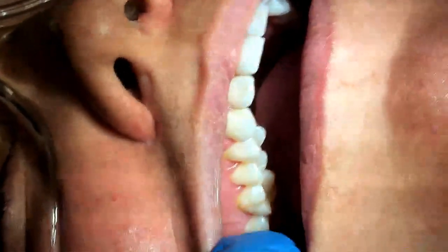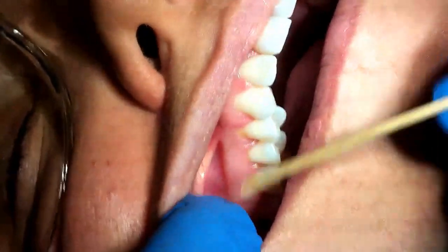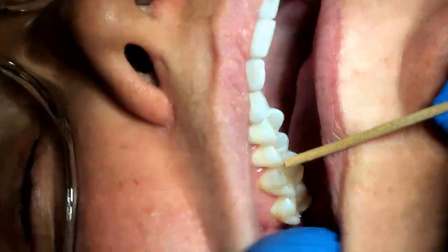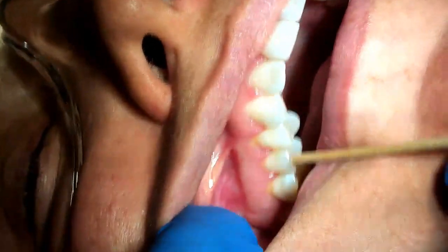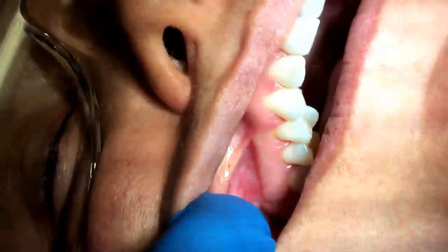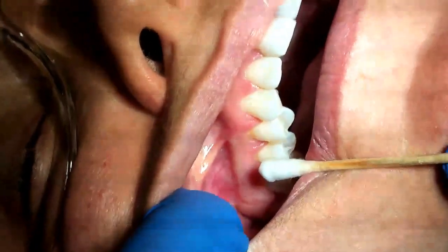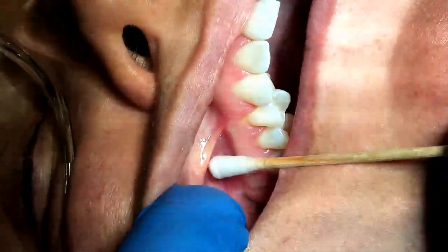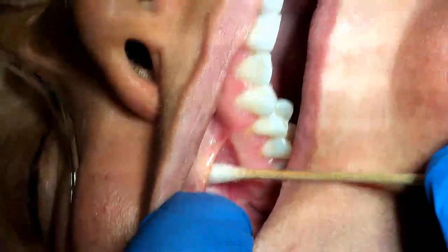Our site is going to be right at the height of the mucobuccal fold, parallel to the second bicuspid. We're just going to parallel our syringe to that second premolar and aim for the apex of that second premolar at the height of the mucobuccal fold.